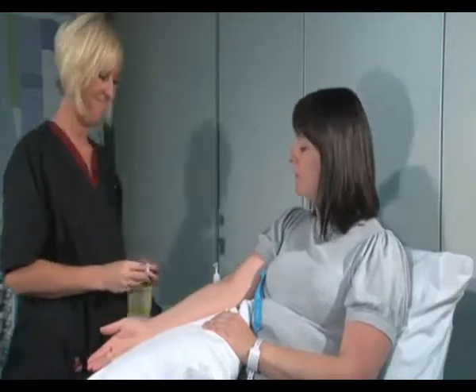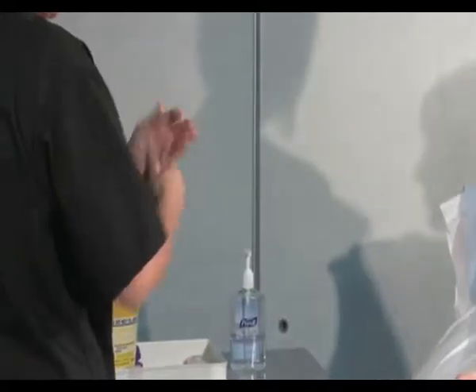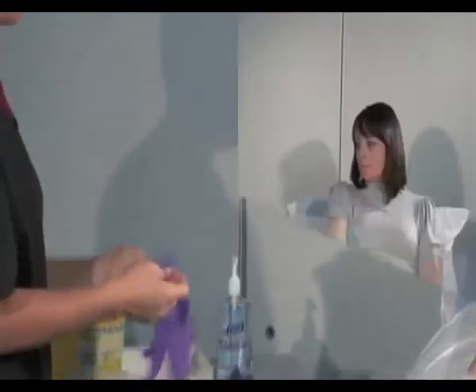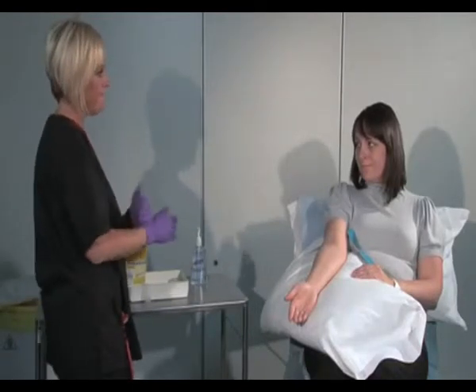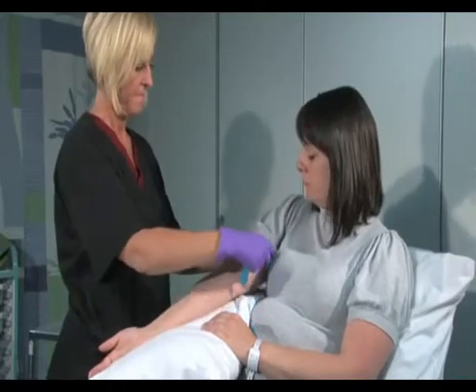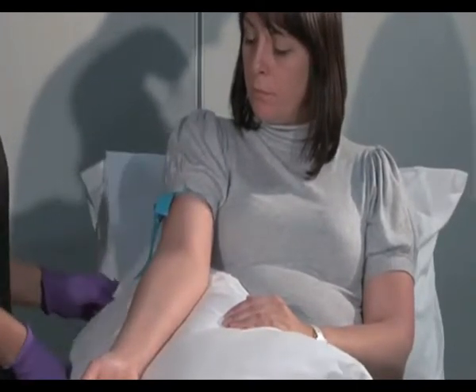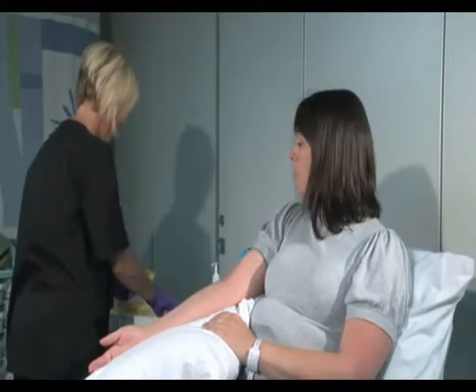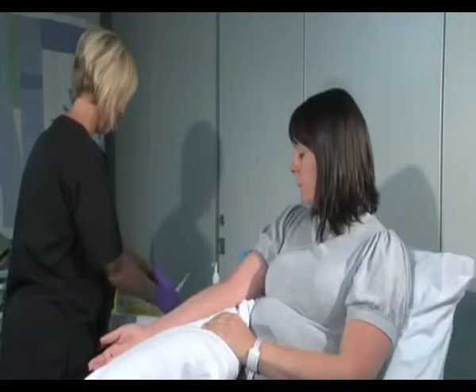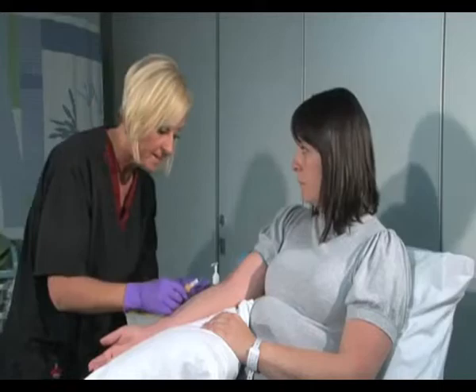I'm going to leave that to dry now. All right, Kelly, just going to check that that's dry. I'm going to pop this tourniquet back on now. All right, Kelly, I'm just going to insert this needle now into a vein. You'll feel a sharp little scratch.